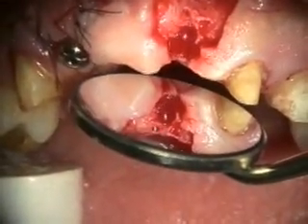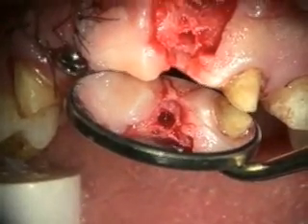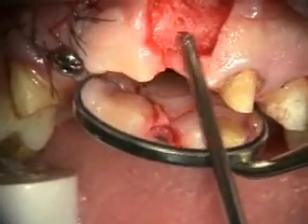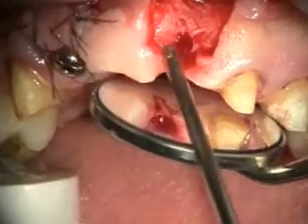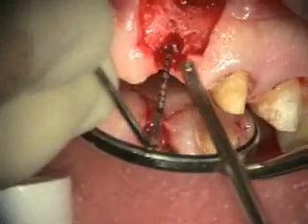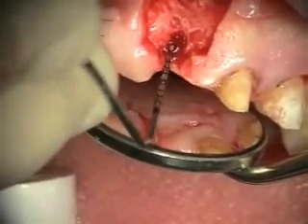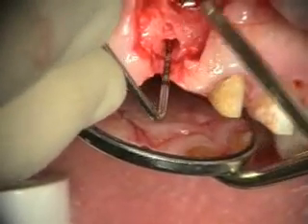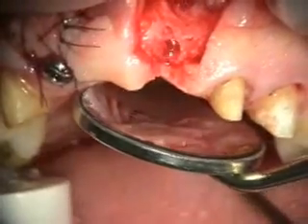If you look at where the center of our osteotomy is, it's a little bit toward the facial. What happens is that the cortical bone on the palatal aspect is so hard it kind of pushes you that way. If we use the expanders, this expands, but it's kind of thin here. If I can get a little more of my osteotomy onto the palatal aspect, then I'm going to try to do that.